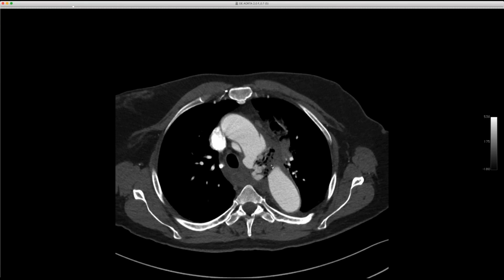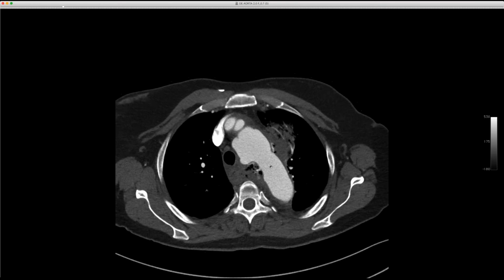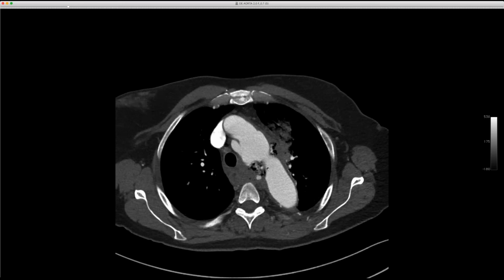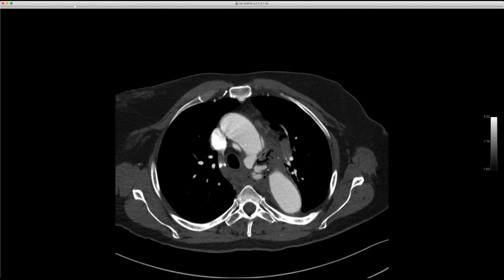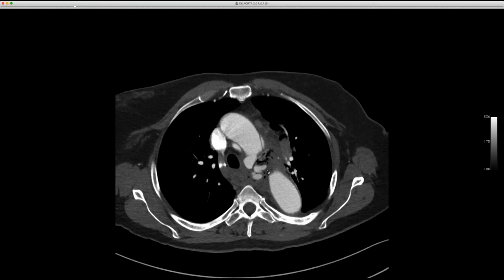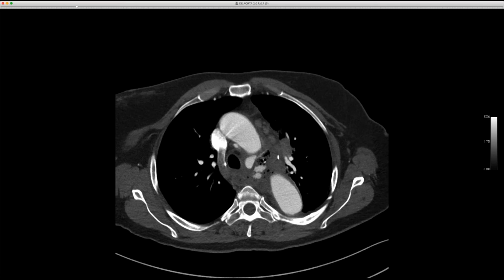So obviously these are really bad. This patient was not taken to the operating room, was just actually coded here, and after they resuscitated the patient, they decided to go to comfort care. But these are pretty bad. One of the rare complications of these things. So given the surgery had been a year ago, presumably the graft got infected somehow, got seeded, and just sort of broke down in here.